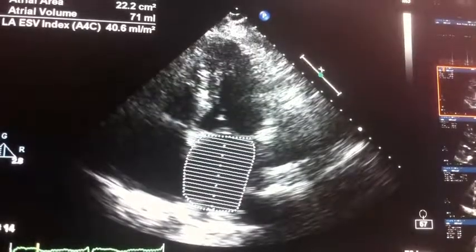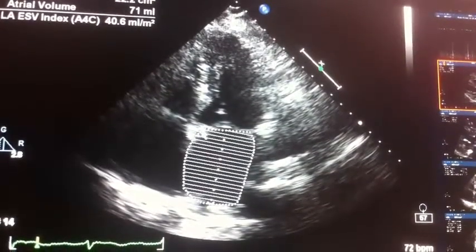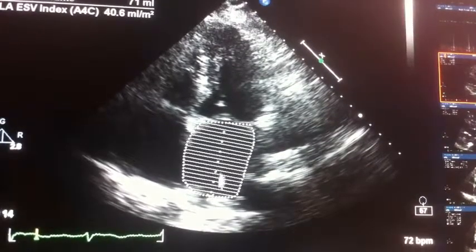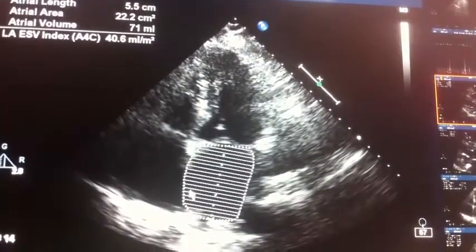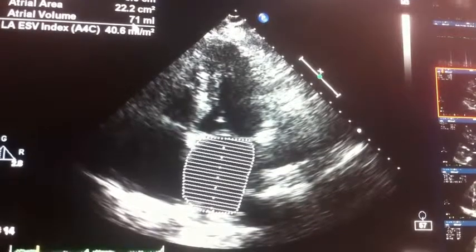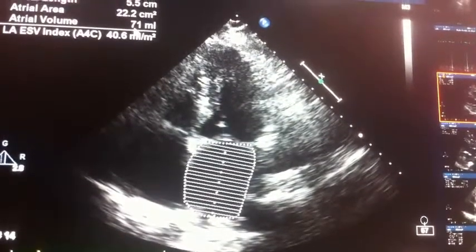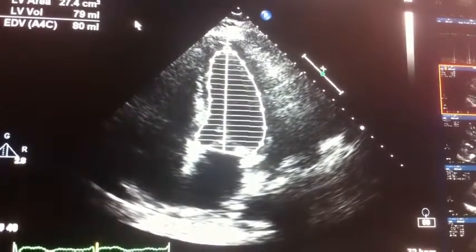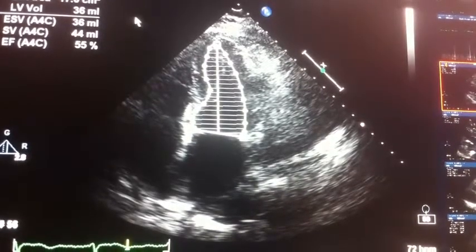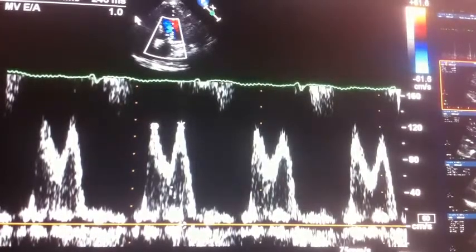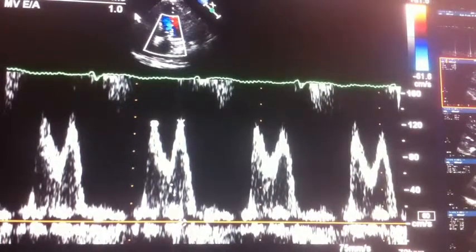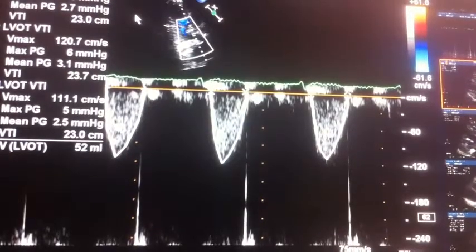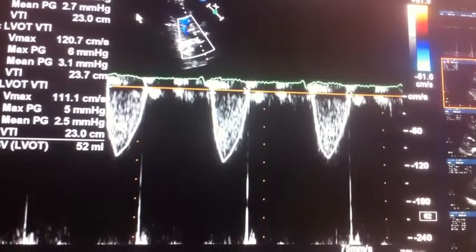There's just a simple peak here. This is actually a volume — you start here and trace around; this is the left atrium chamber. Stop there, then define the length of this chamber, and from that we can derive a volume of 71. This is another volume looking at the left ventricle; from this we can calculate ejection fraction and how well this chamber is working. That was diastole and this is systole. Here's the mitral valve showing the peak E, the A, and that deceleration time. There's another peak velocity.